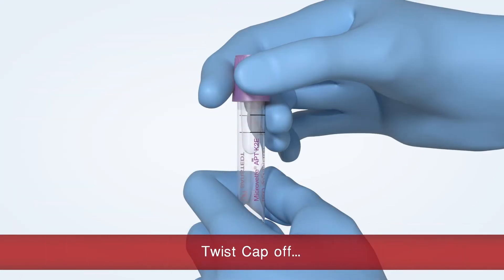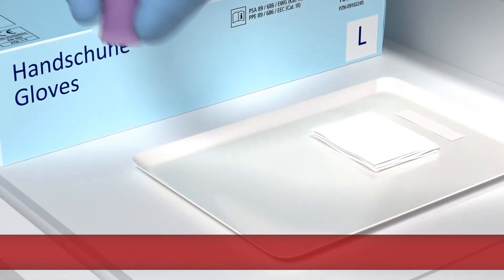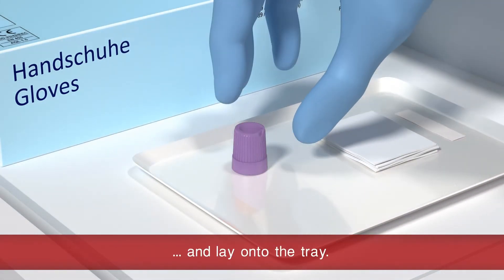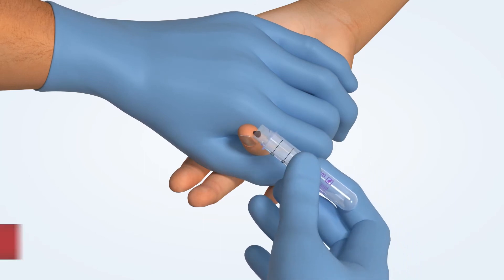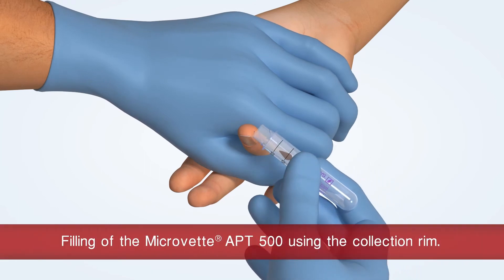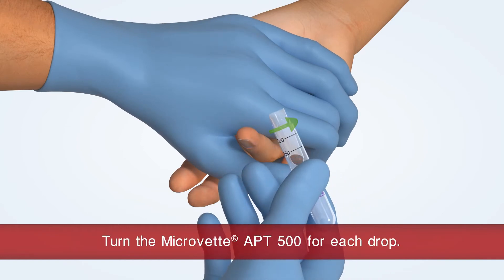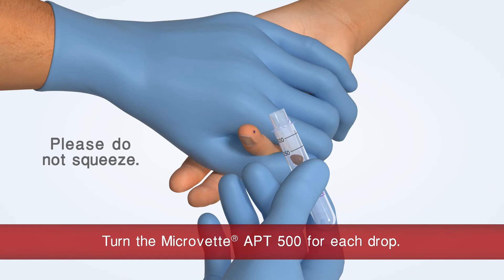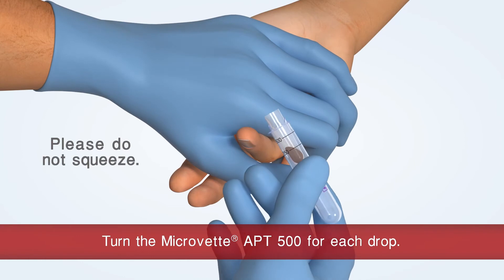Hold the MicroVet APT500 and twist off the cap. Fill the MicroVet APT with the help of the collection rim. Make sure that you continue to rotate the MicroVet APT after each drop. This ensures good mixing with the preparation and prevents the formation of clots.